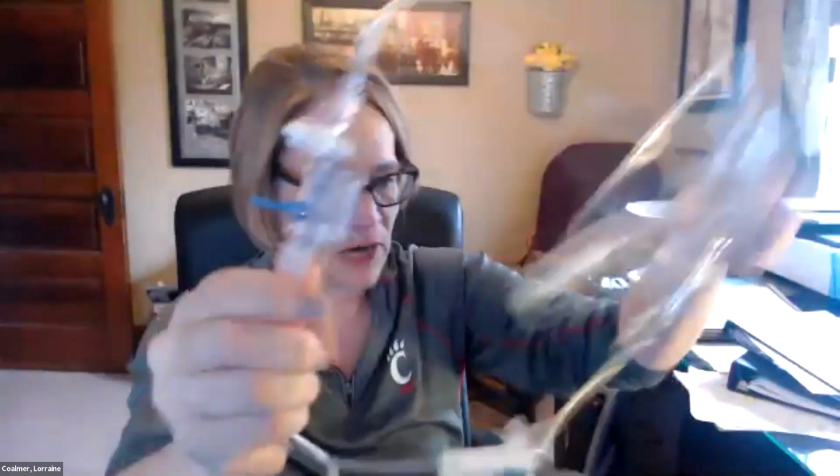This is the pressurized tubing that connects to the pressure bag. This is a pressure bag. We would inflate it up to 300. It's going to connect to this pressurized tubing. This is the transducer. This is the end that plugs into the cable into the monitor. If we are not plugged into this, we do not get a waveform. So we're going to have a cable that comes off the monitor that will plug into this.